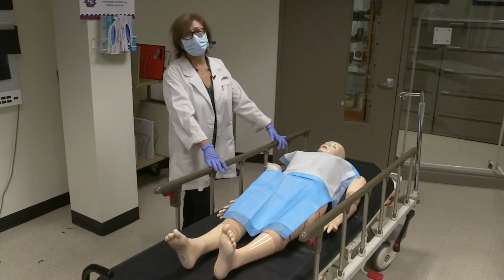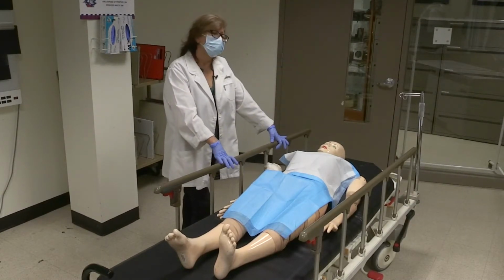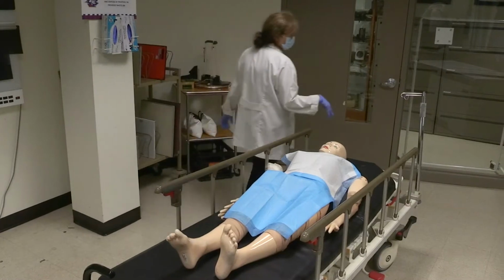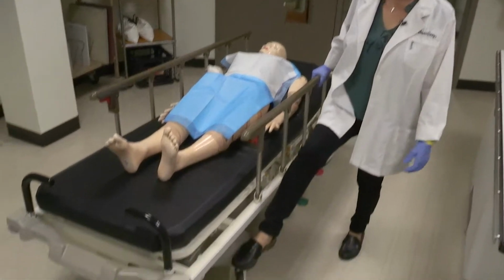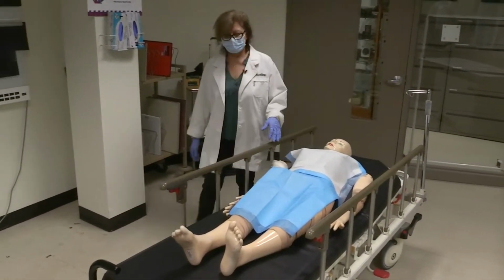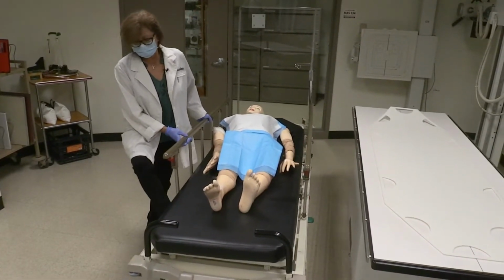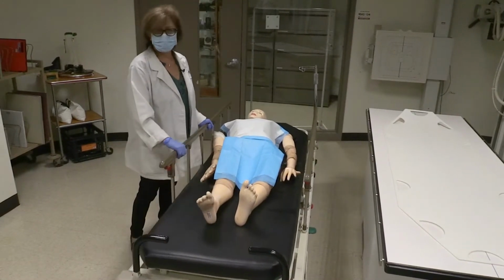So let's talk about bringing this patient over to the radiographic table and they need assistance. I'm going to undo the brakes. The brakes are on all four of the wheels, right here, right here. And when the brake is in its neutral position, the stretcher can be easily moved around.